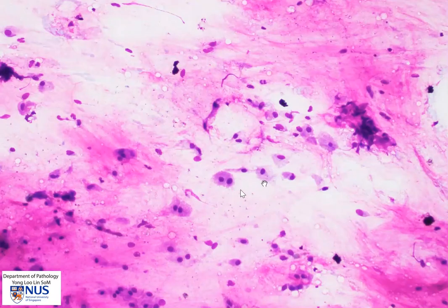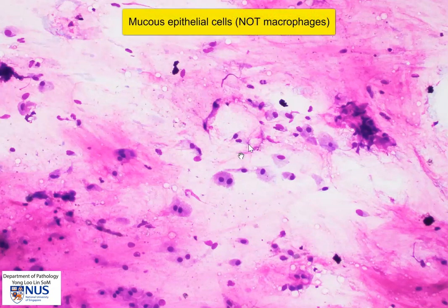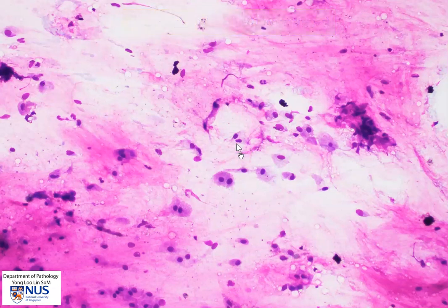We also have these single cells which quite closely resemble macrophages in the background. These are very polygonal, very large, and have extremely low NC ratios. These are likely to represent mucus cells and should not be mistaken for macrophages. Usually the nuclei are more eccentric, and the cytoplasm is not as foamy as you would see in macrophages. Also, the nucleus is not bean-shaped.